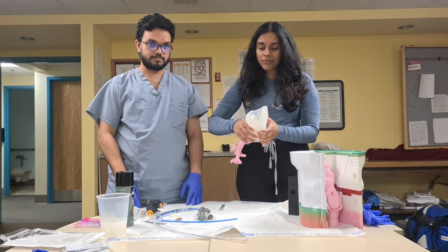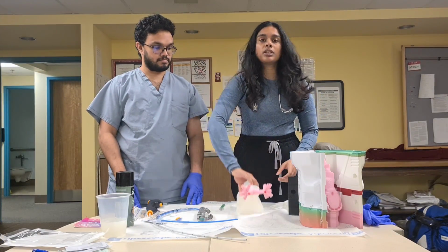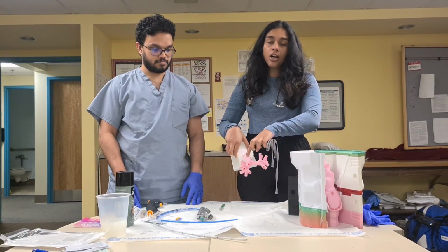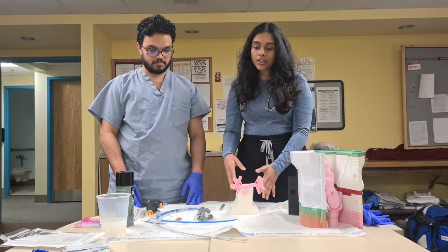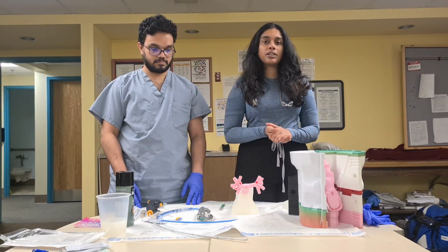As you can see, we can clearly see the teeth, the tongue and the uvula. And when we go in with our bronchoscope, we'll be able to see the vocal cords as well as the tracheal rings that lead into the 3D printed bronchial tree model. So this is the finished model, and it's ready for bronchoscopic training or for intubation training, both of which we're going to demonstrate right over here.